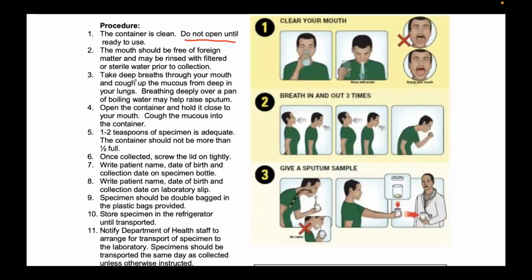Number 3, take deep breath through your mouth and cough up the mucus from deep in your lungs. Breathing deeply over a pan of boiling water may help raise the sputum. So usually yung mga sputum samples natin, mas maganda po sa umaga talaga siyang kino-collect. Open the container and hold it close to your mouth. Cough the mucus into the container.